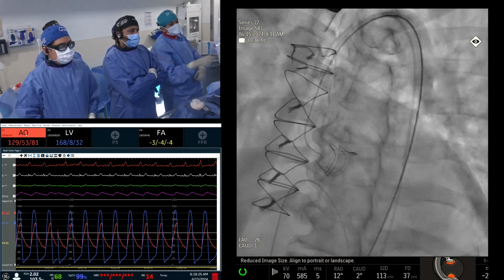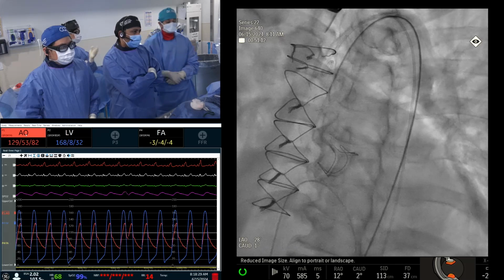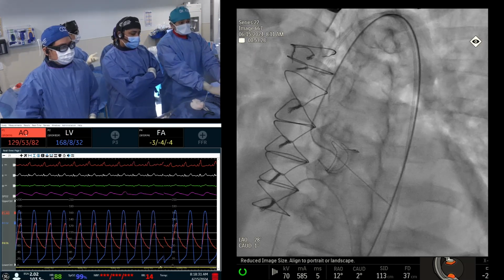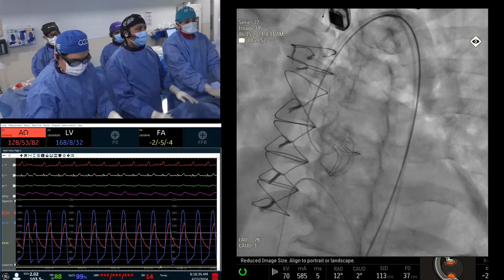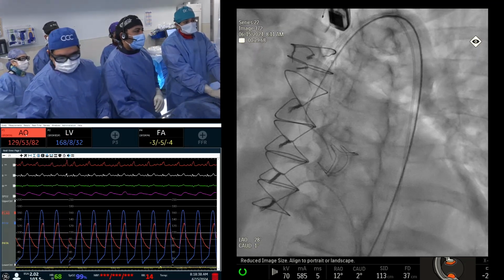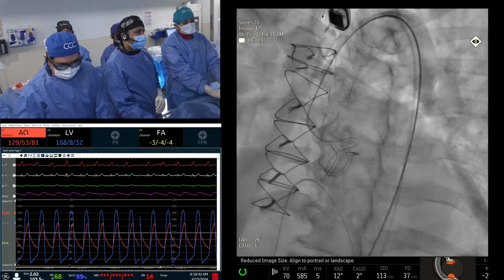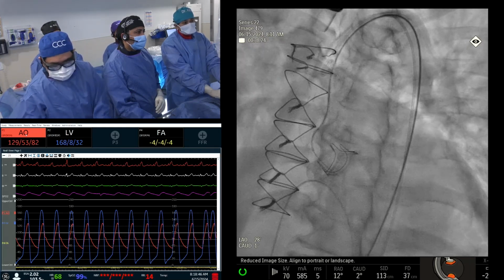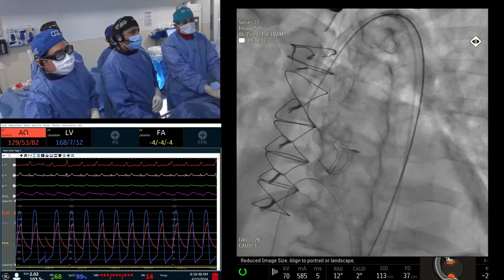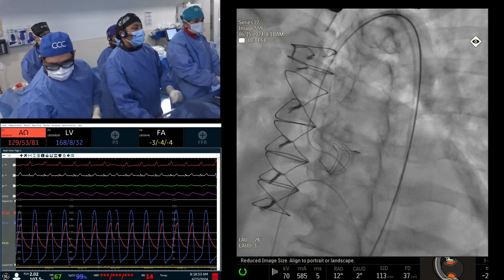Look at it, we are in LAO. Very rarely do we take patients to LAO. The anatomy is very rotated. That's the issue. And to your point, you kept hitting the sinuses otherwise, right? In a big sinus situation. Okay. So very nice. Rotate clockwise and counterclockwise with your left hand, the catheter within AR2, and then use your straight Terumo wire. Be gentle, right? Do not go in the side, and then we get it to the pigtail.